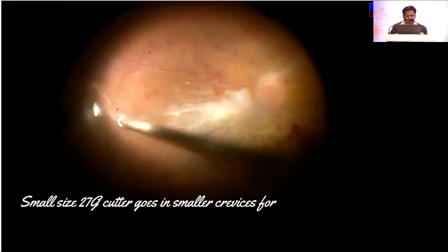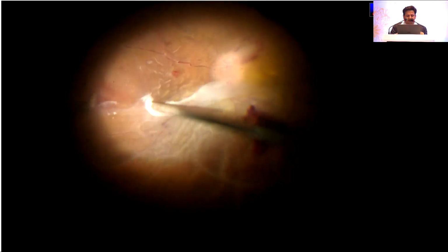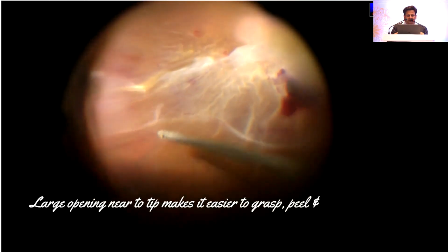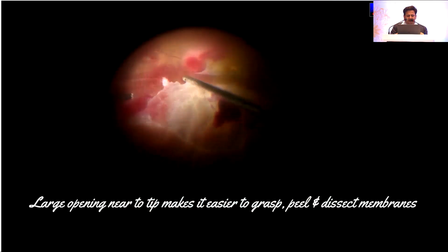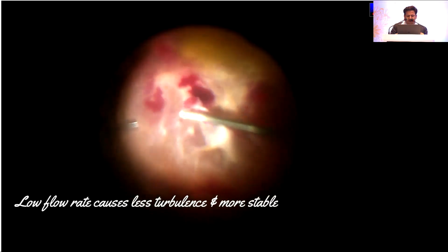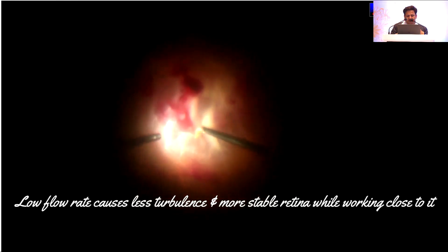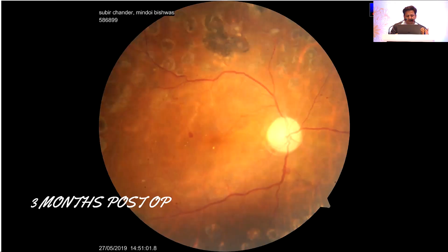Because I've started at the disc, I've got the right plane, and I have induced the PVD at the periphery. So I just have to go around these epicenters. We don't need to cut through them. We just go around them. So this is how, and I use the minimal possible gauge cutter which is available, and that helps me to cut these membranes with the cutter itself. So this is what around-the-table dissection is, and you can do most of your surgeries using this technique.